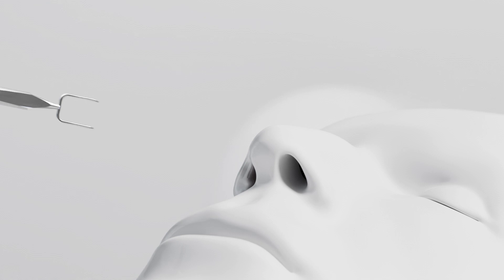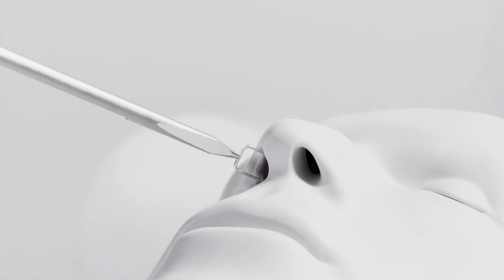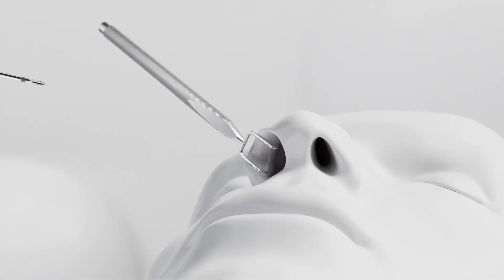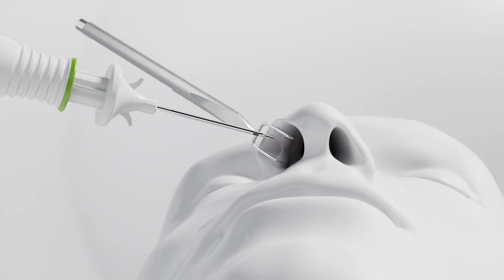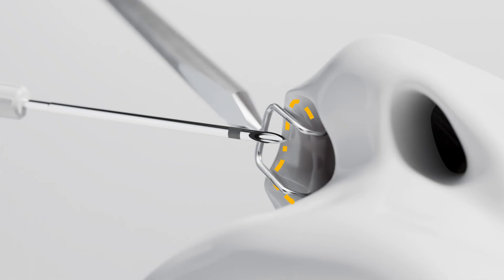Using the ALAR retractor, evert the ala with the index or ring finger. Hold the ALAR retractor close to the prongs for greater control. Align the Latera device perpendicular to the septum — the bevel will be towards the septum and the depth marker will be visible. Pierce where the internal nasal lining begins, close to the ALAR rim. Maintain the perpendicular direction until the depth marker is barely visible or disappears.